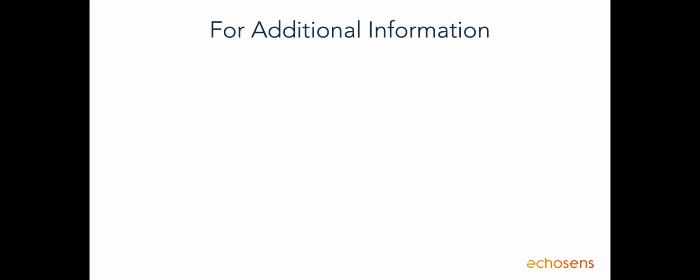To refer to what this means, please watch my separate presentation on the FAST score, in which I explain the inputs, the formula by which this is calculated, and how to interpret a FAST score.